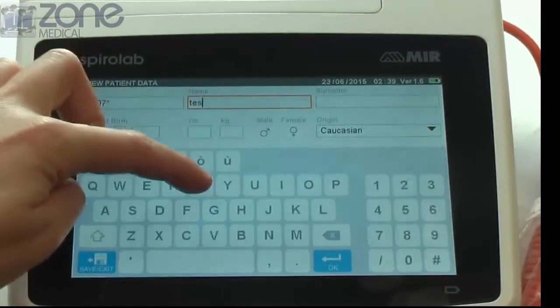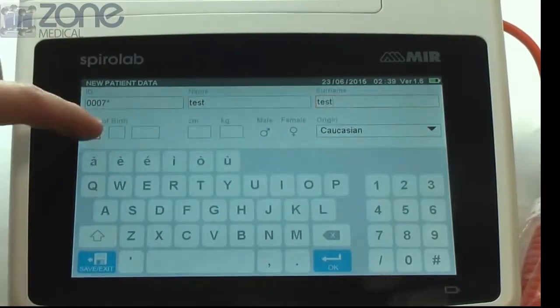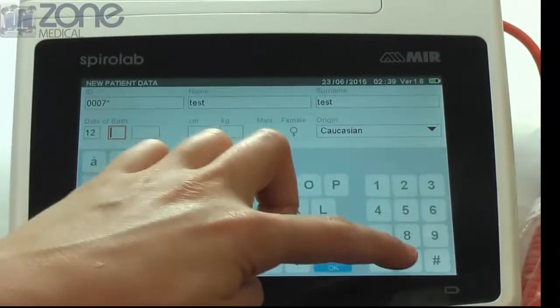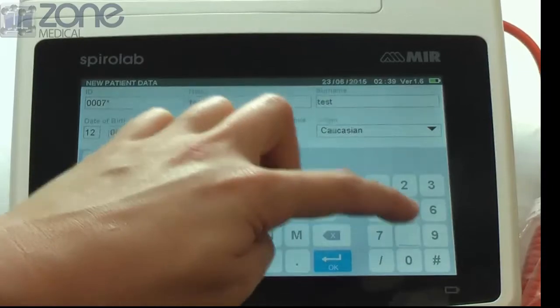From here you may add any preferred ID, name and last name, date of birth, height and weight, gender and ethnicity. These results are vital for an accurate test.